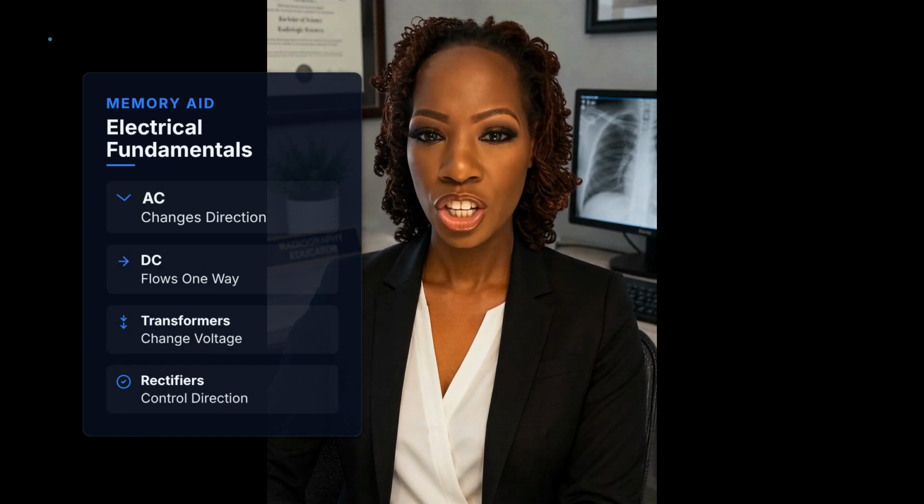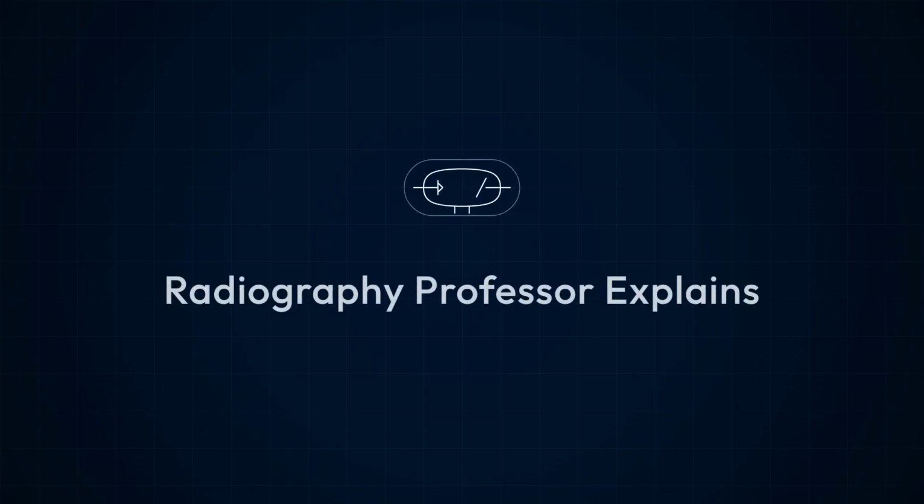Here's a simple way to remember these concepts. AC changes direction, DC flows in one direction, transformers change voltage, rectifiers control the direction of current. And ultimately, rectification protects the X-ray tube from inverse voltage and ensures the proper electron flow necessary for X-ray production. Understanding these relationships will help you see how the X-ray circuit ensures electrons travel properly from the cathode to the anode for X-ray production.